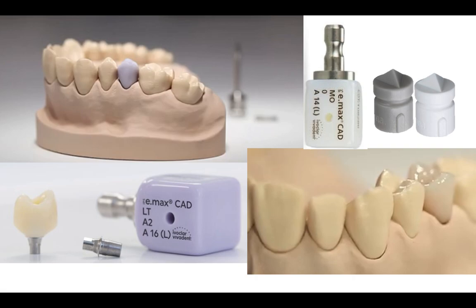You are most likely going to be exposed to this before you graduate. Just keep in mind that those are scan bodies, and you need those if you want to have a provisional restoration. And if you want to have a permanent restoration, you need to have a Vario base or a T base. You need to cement the crown outside the mouth, and then you're going to get the implant crown in place, already cemented to the abutment.